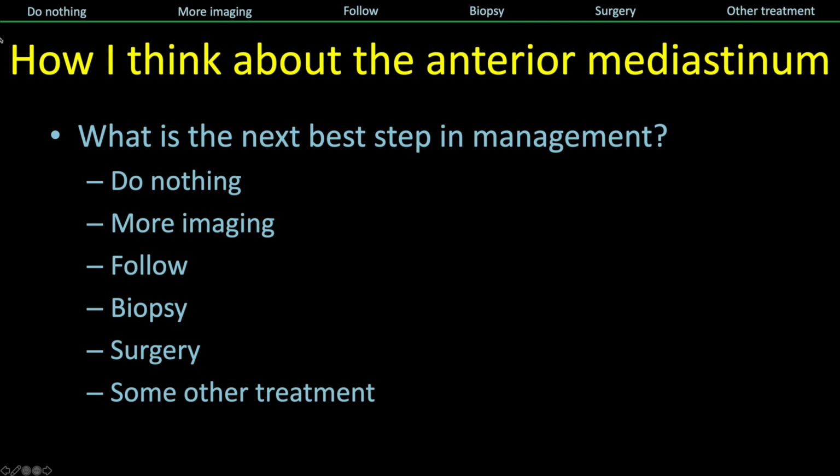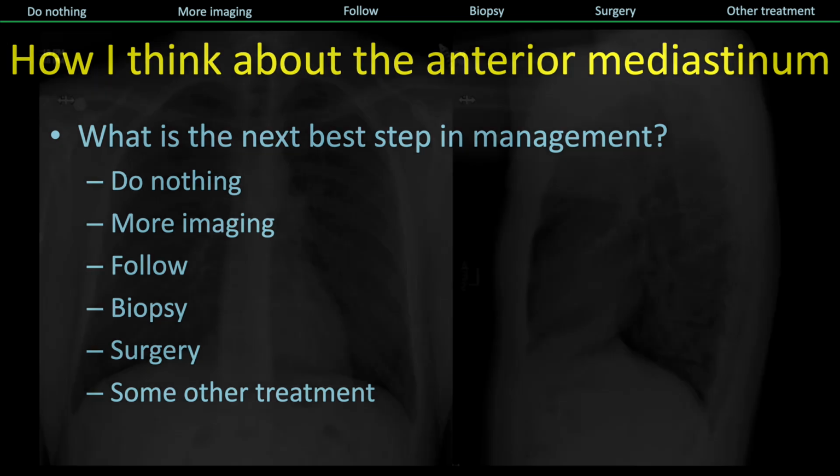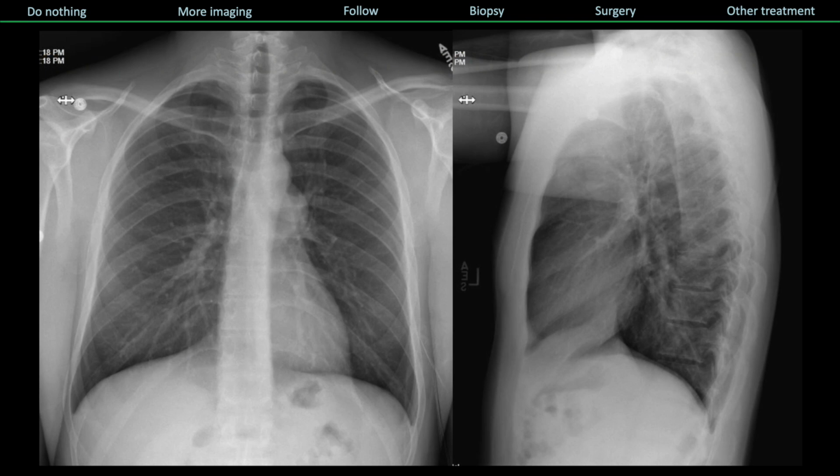The question is going to be at the top of the screen. After I show the case, the answer will light up, so you can kind of play along as the cases are shown to you today. All right, let's start. We got a case here.